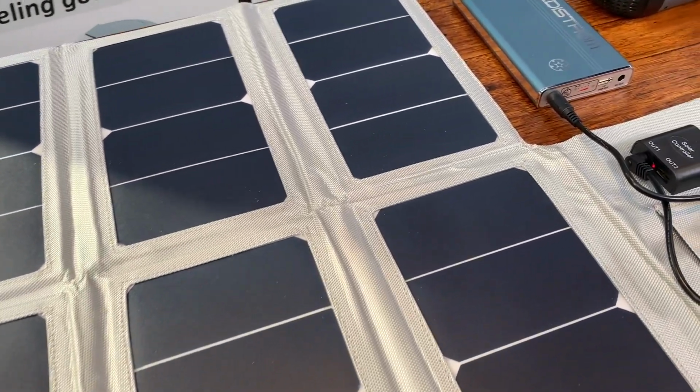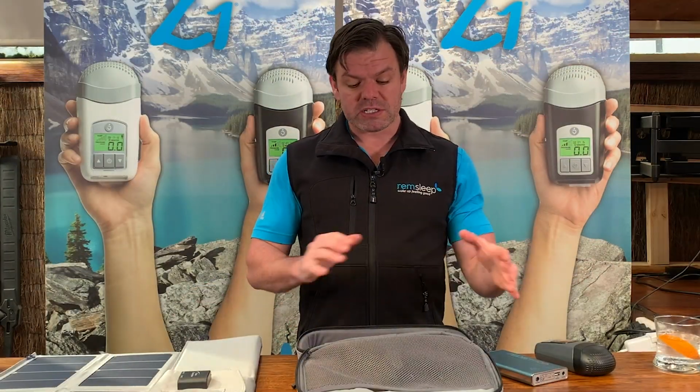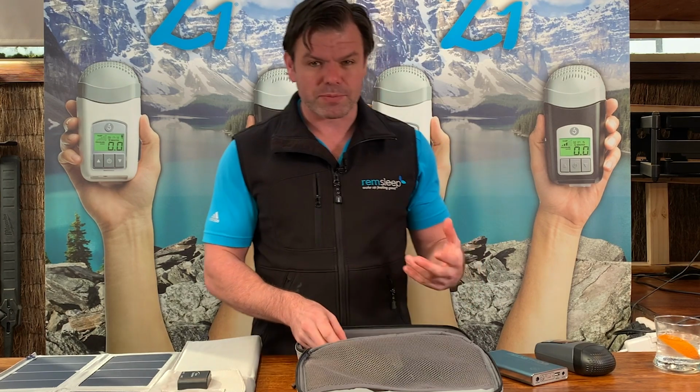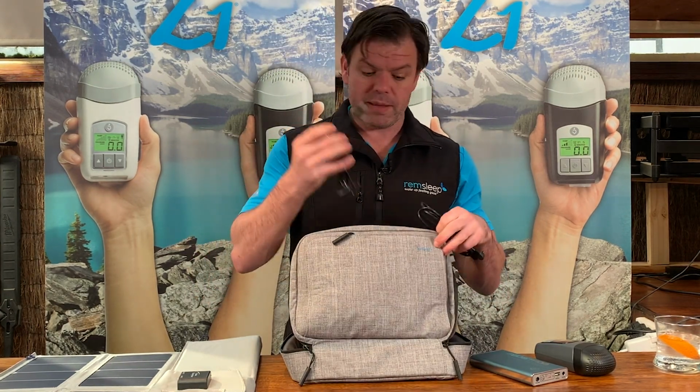Now, I'm gonna quickly run through how this gear sets up, connecting up the battery to the machine, connecting up the battery to the solar, and just take you through the different components because sometimes people get a little bit confused with that sort of stuff. So the pack comes with a few different cables that you're gonna need.